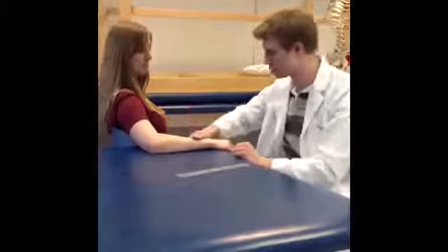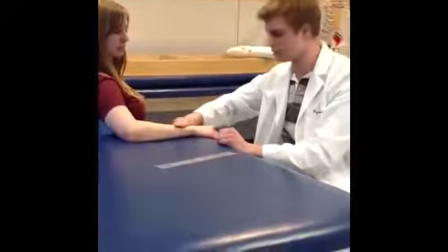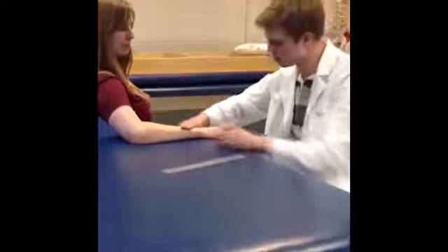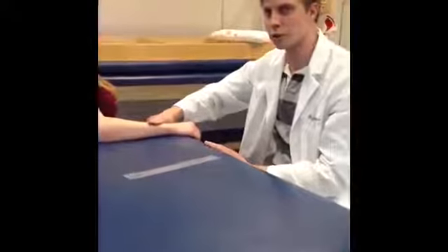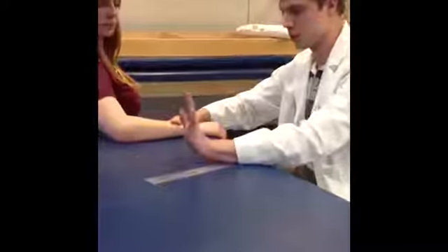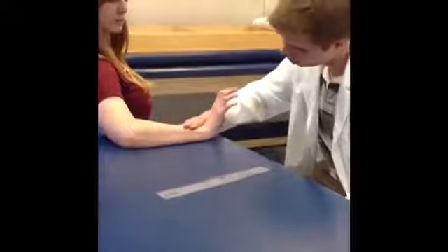So first thing you do is you want to stabilize. I like 2 fingers on the top of the radial and ulnar shafts. That prevents supination and pronation. So then I'm going to ask you to, once again, bring your hand towards your elbow joint.